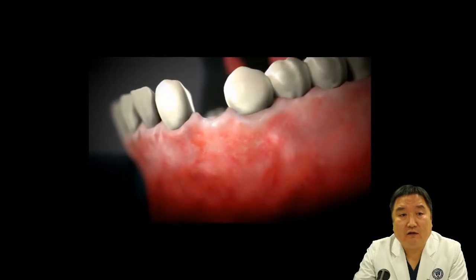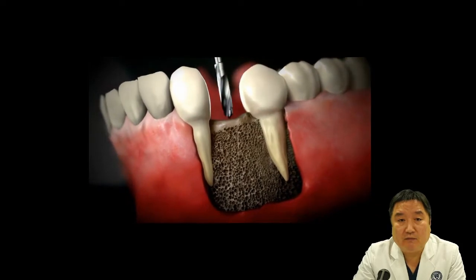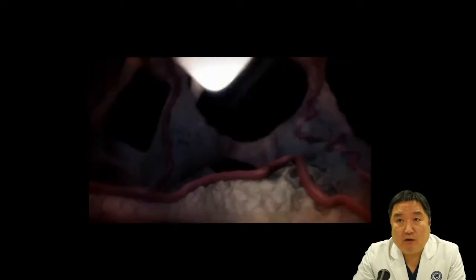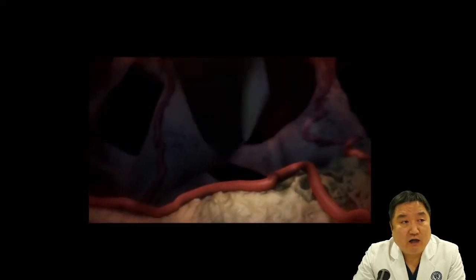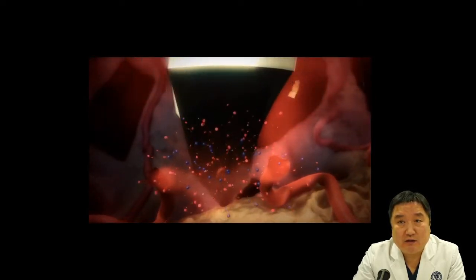I'm going to show you a very short video clip to explain a possible reason for that occurrence. Upon implant surgery, there will be hemorrhage and many cells and cell proteins will be released.